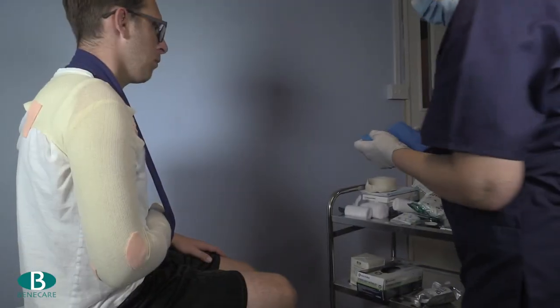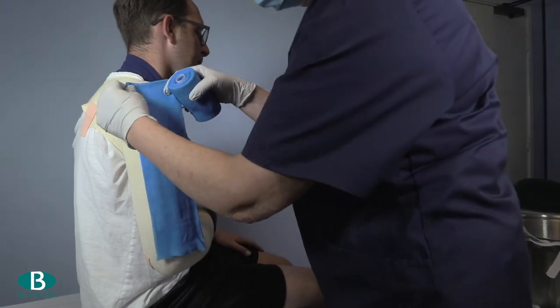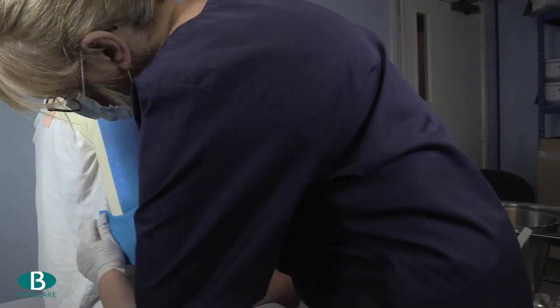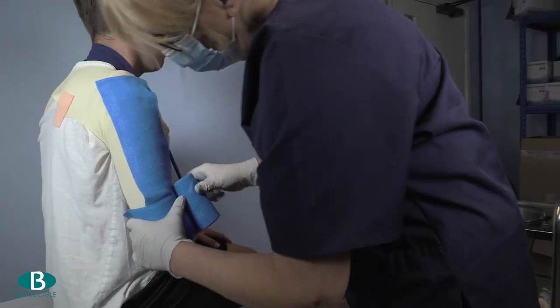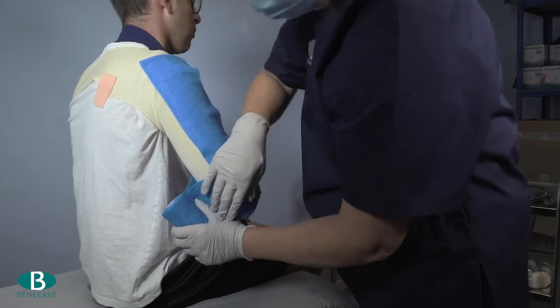Position the slab longitudinally from the shoulder to the elbow and using the remaining bandage secure the slab by bandaging from the distal aspect of the limb, covering 50%, working up the arm to the axilla.